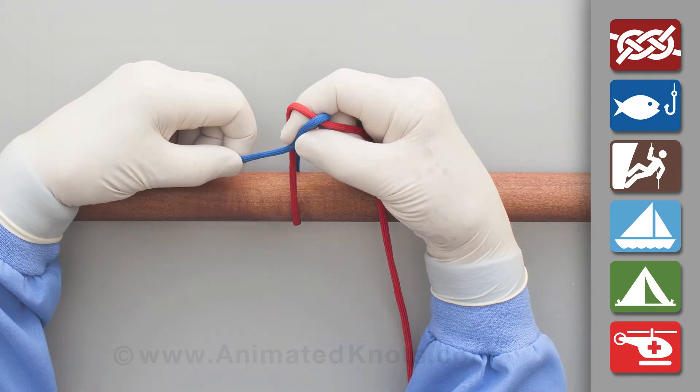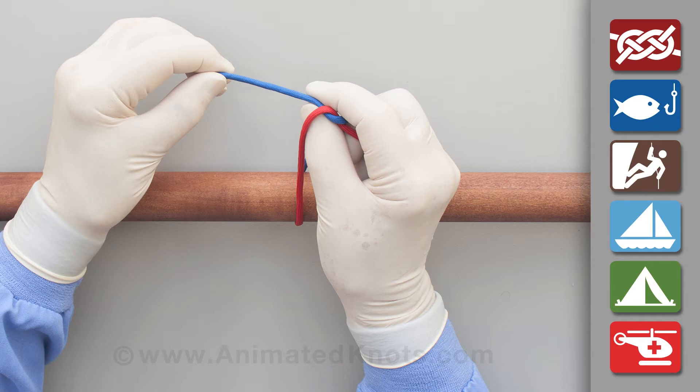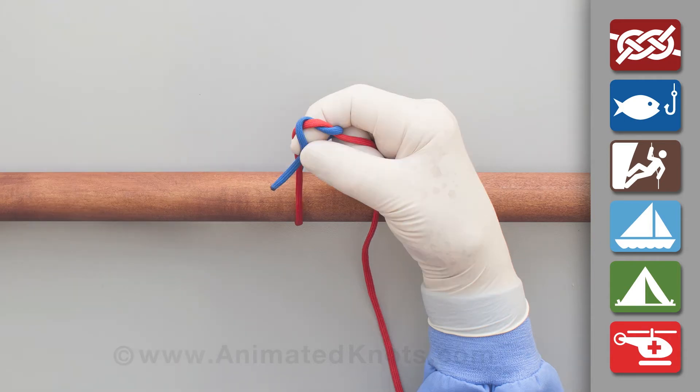Lay the short end between your finger and thumb, and use the thumb to push the end through to form a half knot. Insert your finger under this knot, place the short end between finger and thumb, and again use the thumb to push the end through.